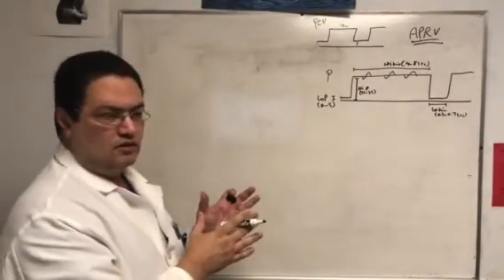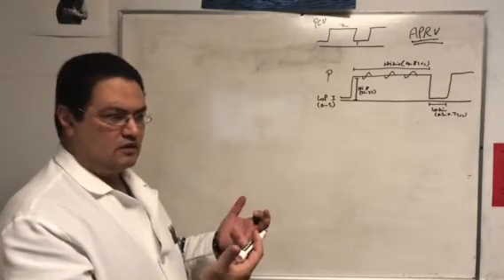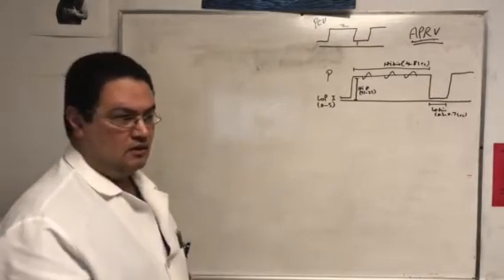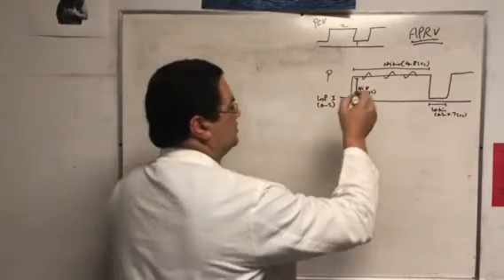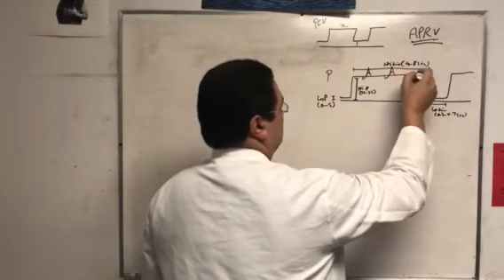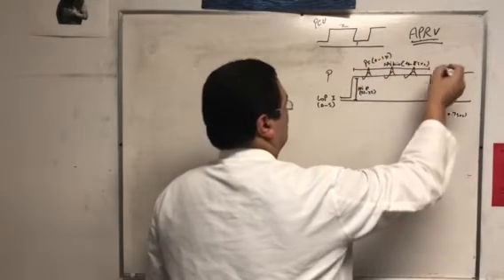All of the settings that I wrote on the board here are startup settings. So they are settings that you start with, but you can deviate from this as you're weaning the patient. You can go 10 seconds, 12 seconds on the high time, for example. In addition, there is also a pressure support. You can support each one of the small breaths with a pressure supported breath, and the pressure support ranges usually between 0 to 10. And then there is the FiO2.